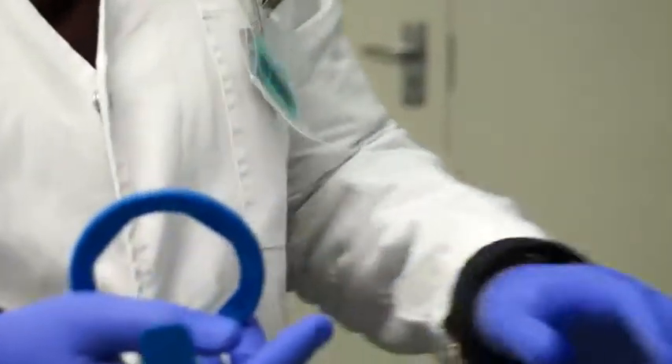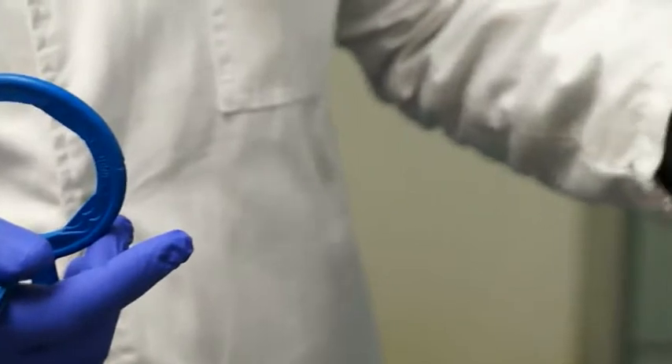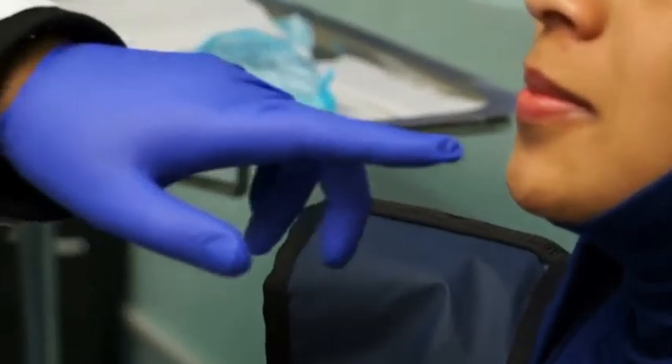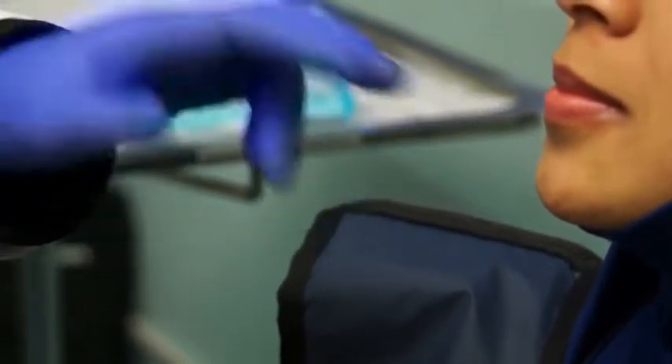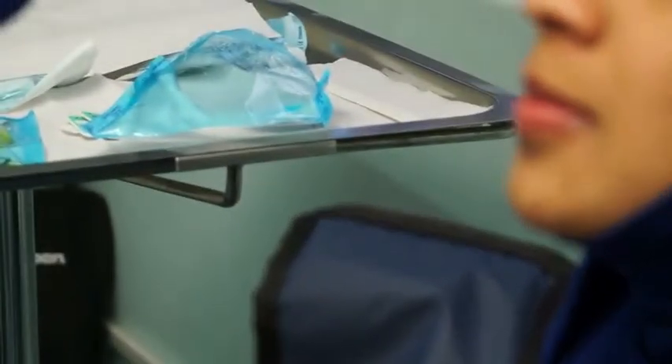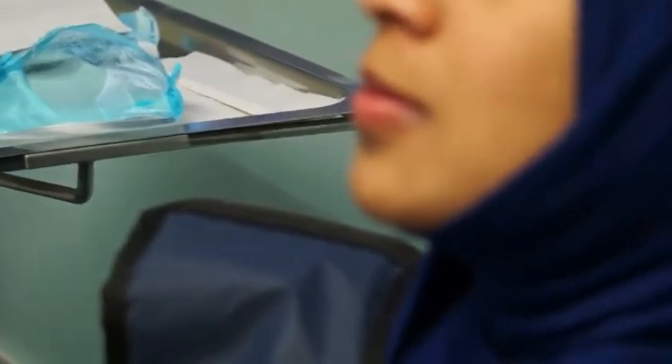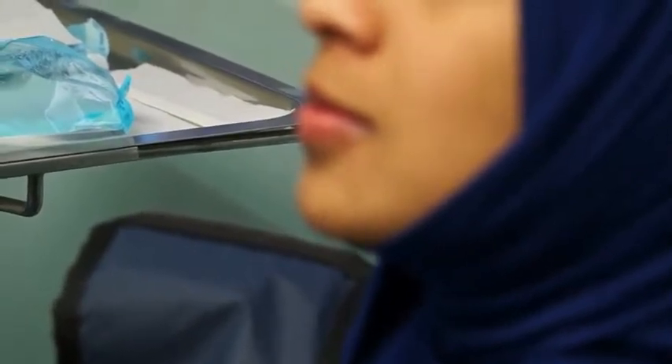For the maxillary anteriors, we take five radiographs altogether: the two central incisors on one film, the laterals on either side, and then the canines. For the lowers, we only do three: the four incisors on one film, your mandibular anteriors, and then your canines on either side. We only take three in the mandibular region because the maxillary anteriors are much bigger, so only the two centrals fit on one film — that's why the laterals and canines are done separately.